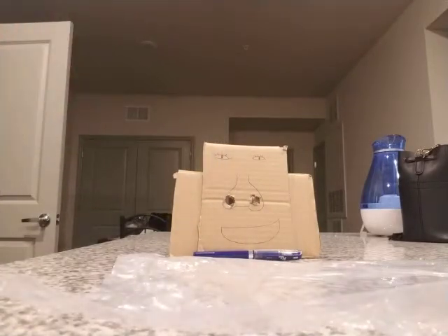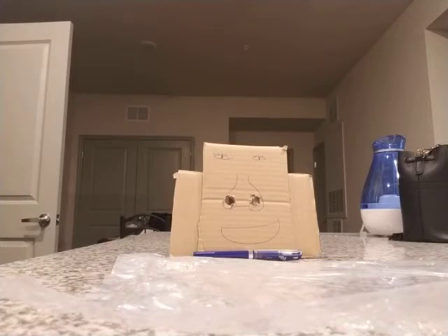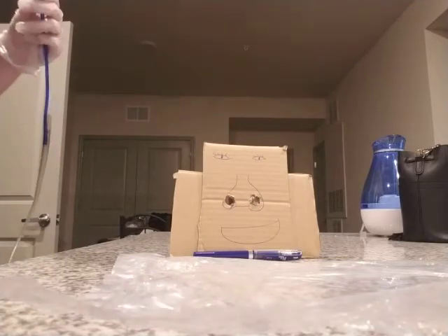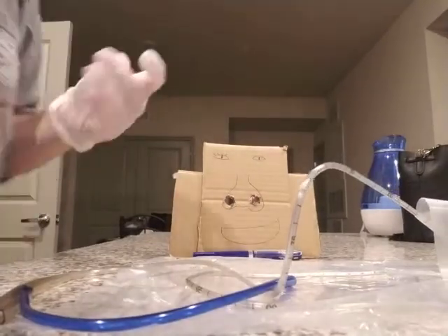I'm going to flush this into a trash receptacle with my 10 milliliters. I'm off camera, I'm still here. I'm flushing this with 10 milliliters of water into a trash receptacle and putting that syringe to the side. And my tubing is now primed and ready to go for insertion.